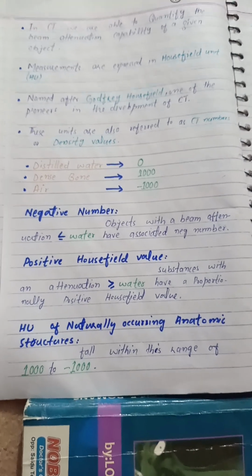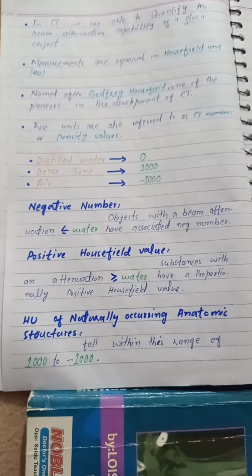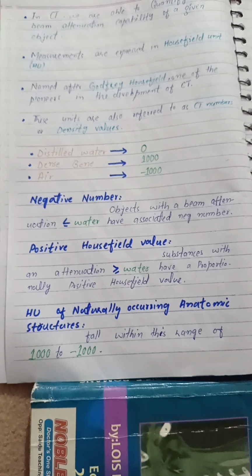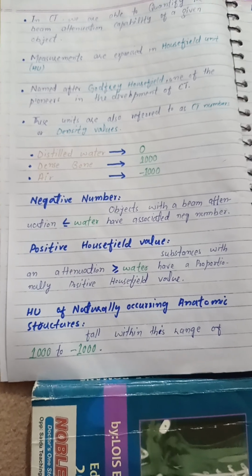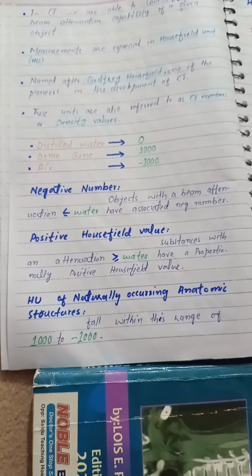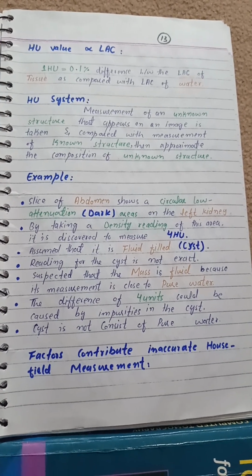Negative number: objects with a beam attenuation less than water have an associated negative number. Positive Hounsfield value: substances with an attenuation greater than water have a proportionally positive Hounsfield value. Hounsfield units of naturally occurring anatomic structures fall within the range of 1000 to minus 1000. Hounsfield unit value is directly proportional to the linear attenuation coefficient.